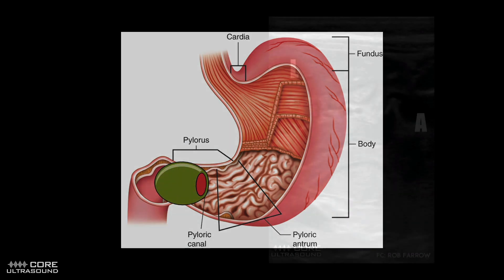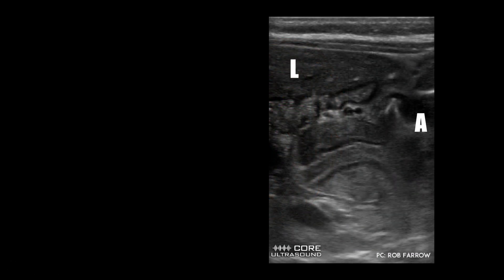Now that we have a basic understanding of our anatomy, we can translate this over to our sonographic anatomy to help us better understand our orientation and landmarks. In this image, in the top left, we have the liver, and on the right of the image, the antrum that extends into the stomach with the pylorus in the center. Keep in mind that the pylorus typically will sit medial and posterior to the liver and/or the gallbladder.